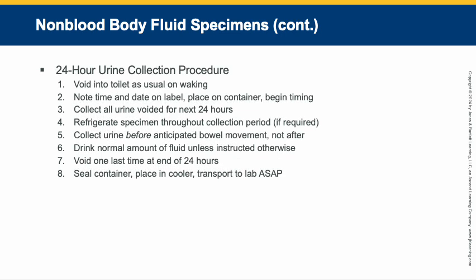Okay, this is a picture that shows a slide of the 24-hour urine collection procedure. One big thing to remember when you're telling patients this: they always want to wake up in the morning and start this and actually void into the container for their first one. That's not how that works for the 24-hour urine.